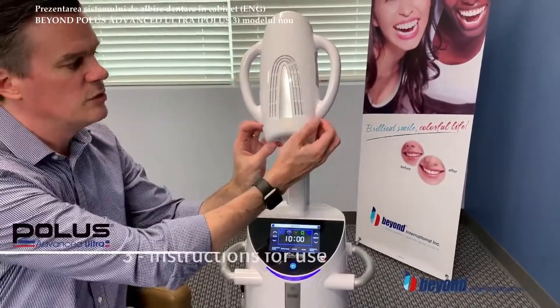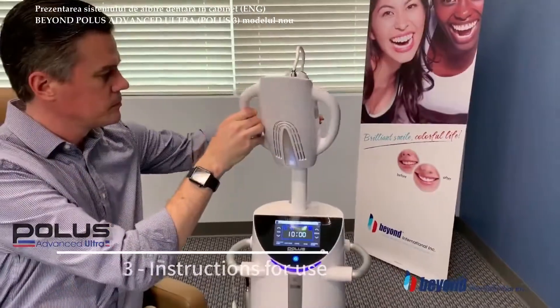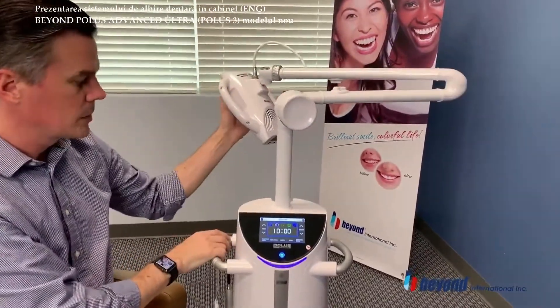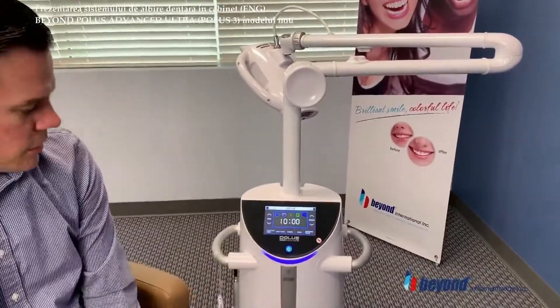Prior to using the Polis, please remove the cover. Now we'll discuss the different features that you have with the Polis unit.